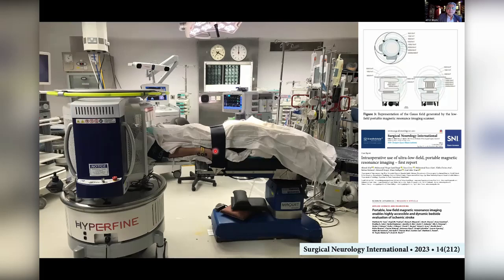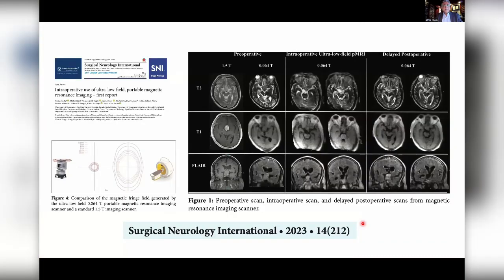The surgery was done. We removed the operating table over here toward the right lower corner, and we moved this in, got the MRI done, and looked at it. How does it look? There are some issues in here, but we are working on how to resolve that. But this is the first time we were able to do an intraoperative MRI in a resource limited setting in an LMIC. And this was a pituitary tumor.